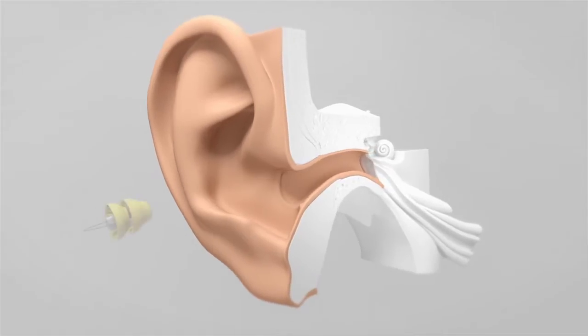The placement deep in the ear canal allows us to use the ear's natural sound transmission properties. This leads to excellent sound quality and localization, and provides a truly natural sound experience. The sound is amazingly natural because the Lyric is very close to the eardrum — just four millimeters away.